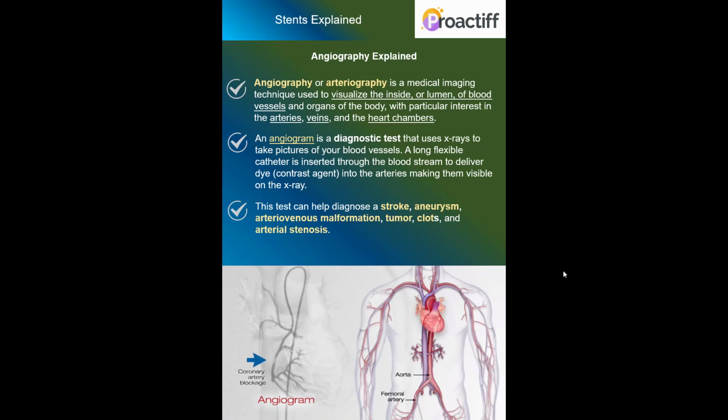Moving further, what is angiography? Let's briefly gain a perspective on that as well. As you can see here, the coronary artery blockage is being addressed with the angiogram. And angiography, or arteriography as it's called, is a medical imaging technique used to visualize the inside, or the lumen, of the blood vessels and organs of the body, with particular interest in the arteries, then the veins and the heart chambers.